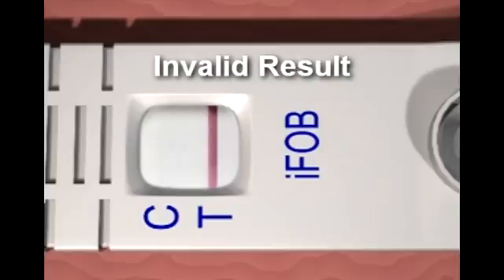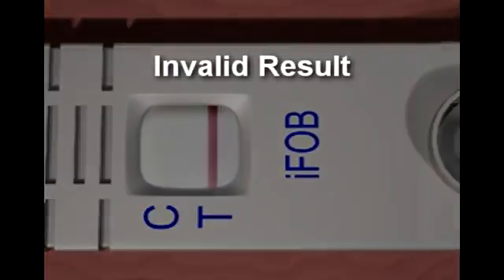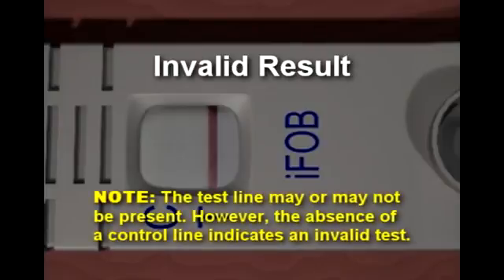Invalid result. If the control line does not appear within 5 minutes, the result is invalid, and the assay should be repeated with a new device. Note: the test line may or may not be present. However, the absence of a control line indicates an invalid test.